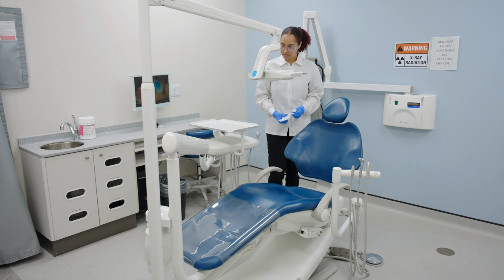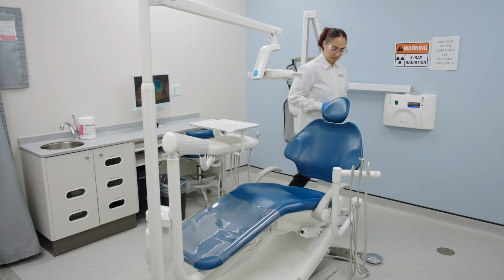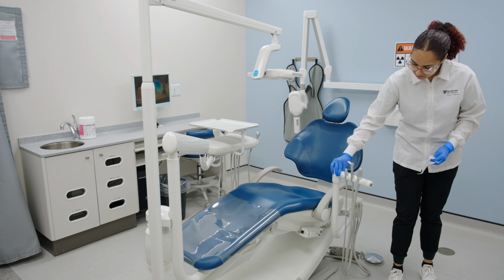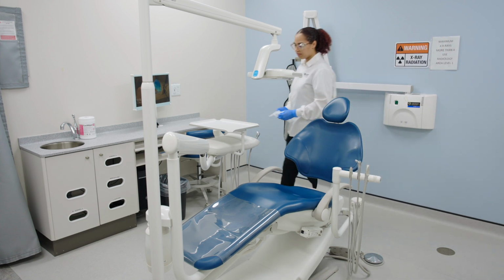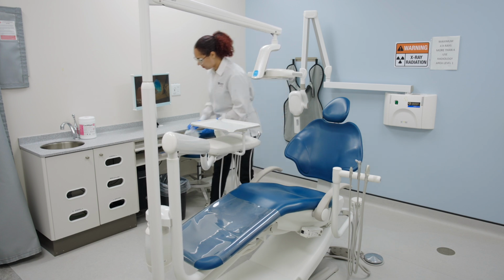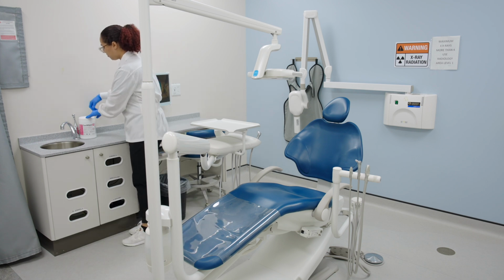Always ensure that the CaviWipe is moist. If not, discard and dispense a new wipe. Be sure to close the lid of the CaviWipe container after use. Once all visible debris or bioburden has been removed, discard the CaviWipe into the trash can. The cubicle is now clean and ready to be disinfected.